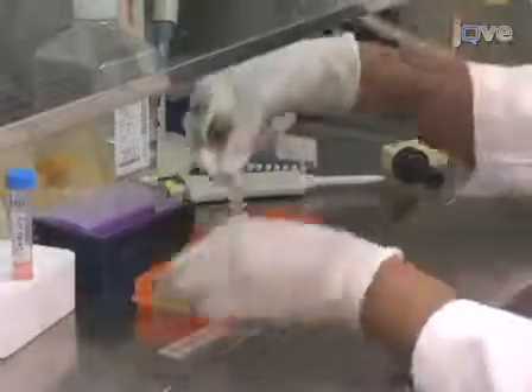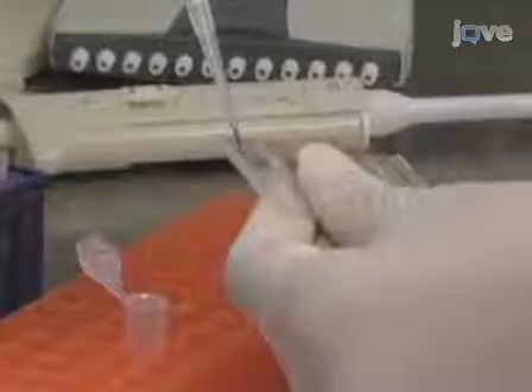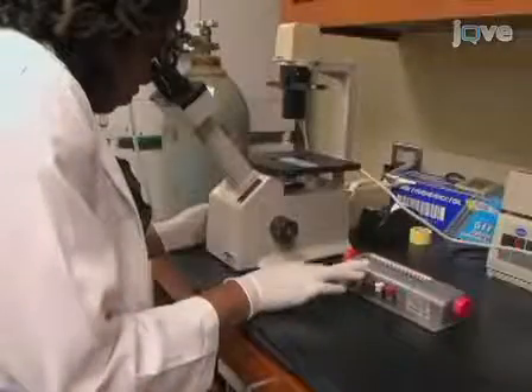These antibody-coated plates are good for weeks. The rule of thumb dictates that a plate can be used if there is still liquid left in the wells. To prepare the cells for this assay, stain freshly isolated peripheral blood mononuclear cells with TriPenBlue for viability and count them.